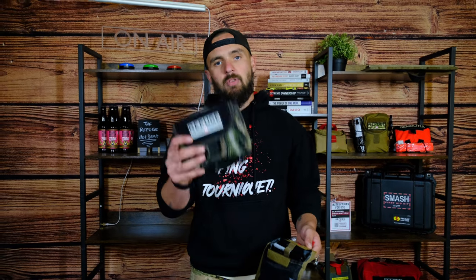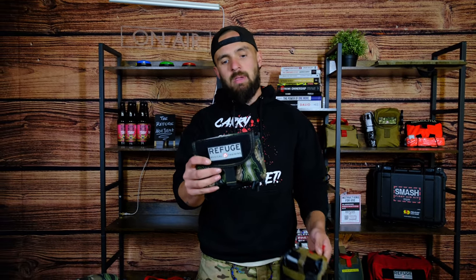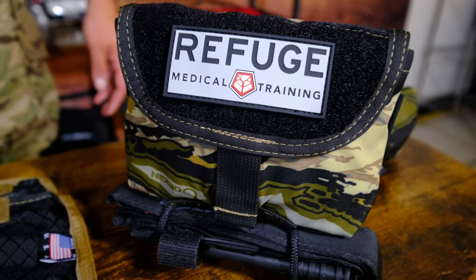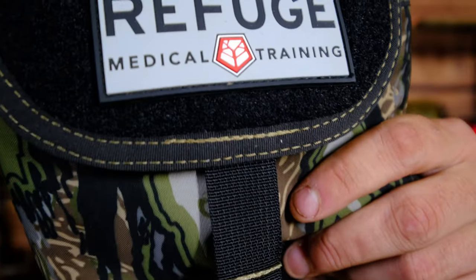This is the Whitetail — a purpose-built IFAC for any hunter out there seeking that big whitetail deer or mule deer. It comes in both highland and woodland Raptor camo, giving you a lighter tone and a darker tone. It doesn't get much better than this, so go and get one while you still can.